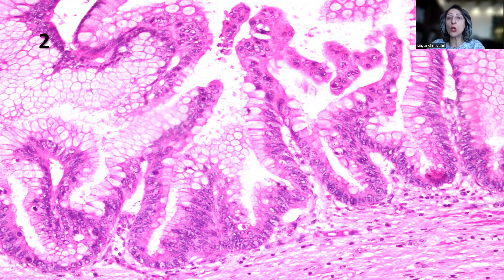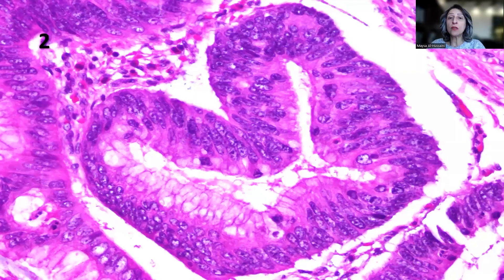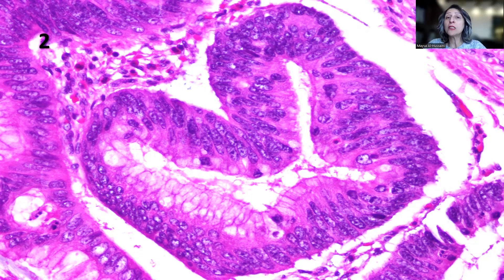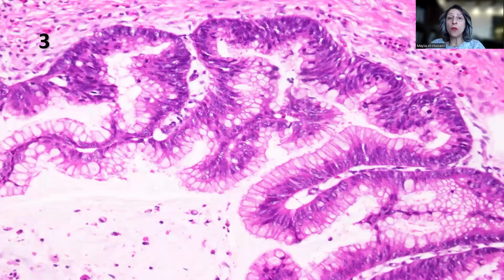If you see this appearance on a biopsy and I tell you it's coming from the colon, you would call it a villous adenoma with high-grade dysplasia. But this is the pancreas. So remember: what really looks like a villous adenoma with high-grade dysplasia of the colon but is present in the pancreas is the pancreatic intraductal papillary mucinous neoplasm.